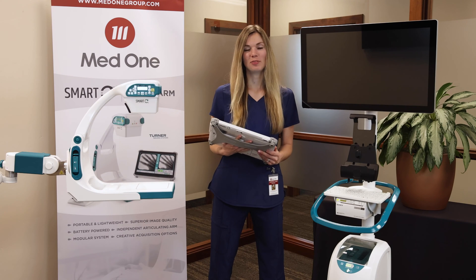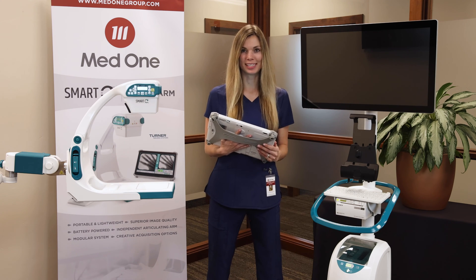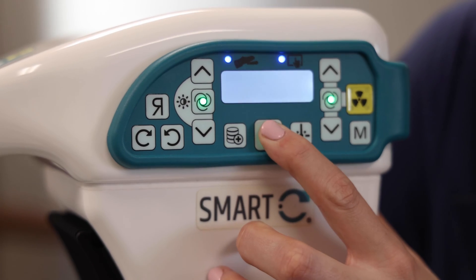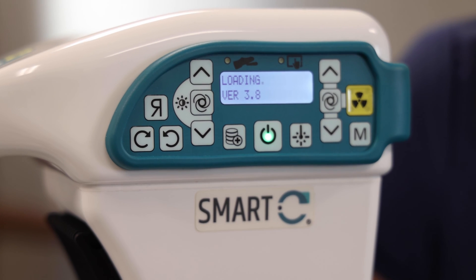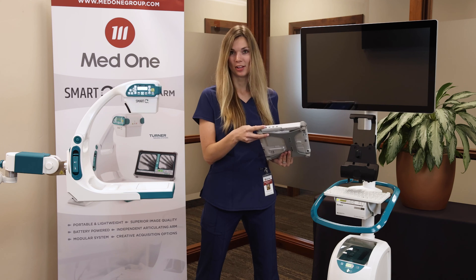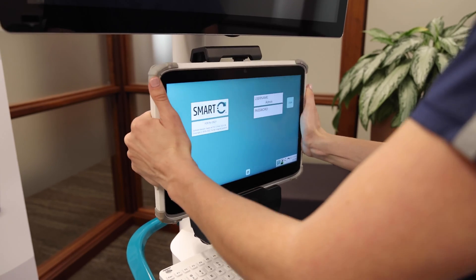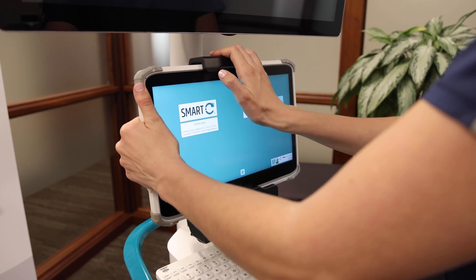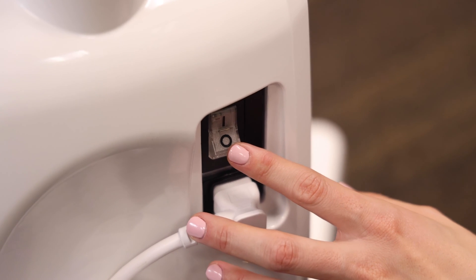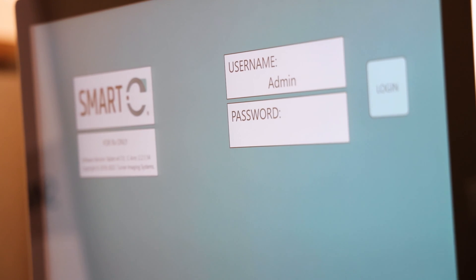For this demonstration, we'll be using the optional support stand and monitor cart. To power up the Smart-C, make sure you have a battery in the battery pocket and press the power button on the head of the Smart-C. It will take about 30 seconds to boot up. Next, turn on your tablet by pressing the button on the side and place it into the docking station of the monitor cart. Make sure your monitor cart is switched on on the back and that the accessory power is on, and when it's ready, your monitor will mirror the tablet image.